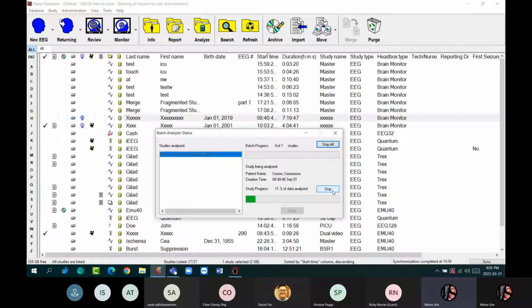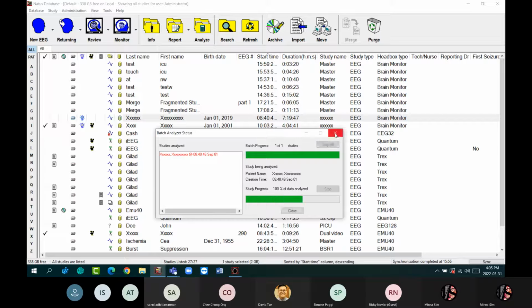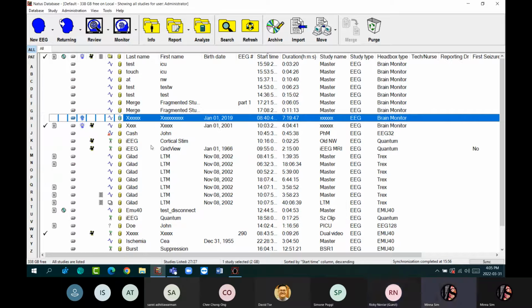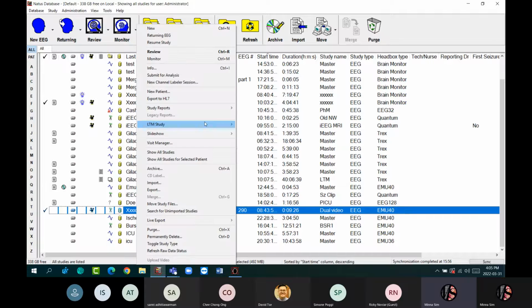Okay, so in that sense, I'm just going to stop and switch to a shorter recording. Okay, this one is quite short, 9 minutes.